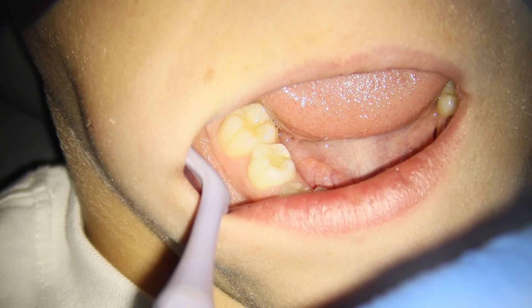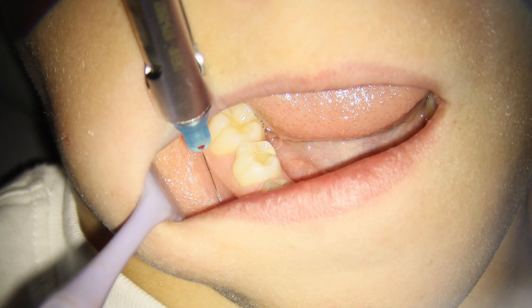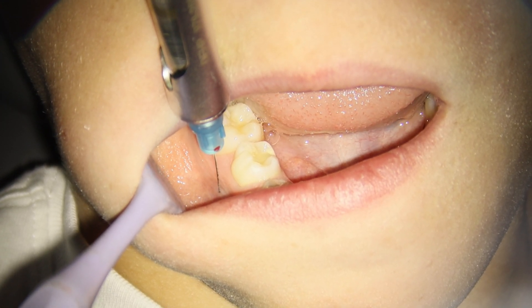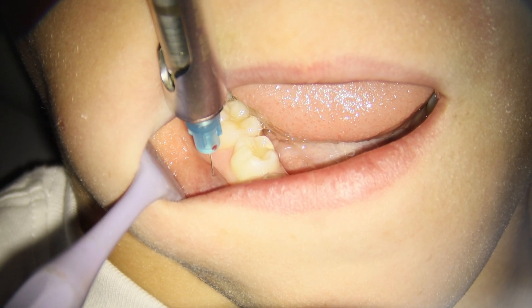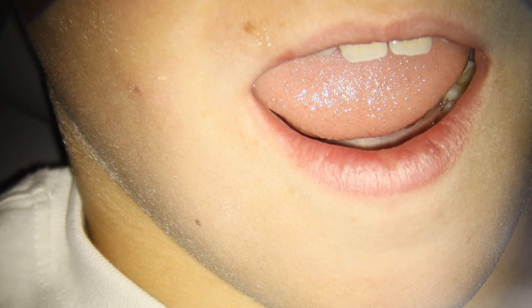Whatever filling we put in here needs to be good, solid, and long-lasting. I did say to the parents that this patient also needs orthodontic treatment, so I'll be writing a letter to the orthodontist asking whether the plan is to keep this tooth or remove it. Regardless, I'm going to put something in there just in case the tooth is required.